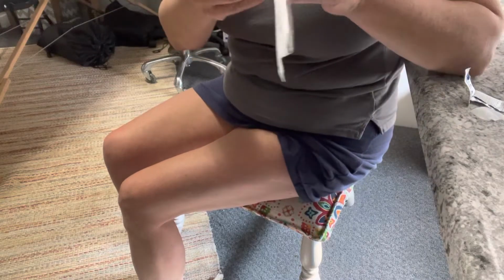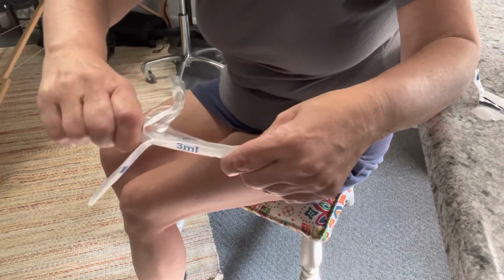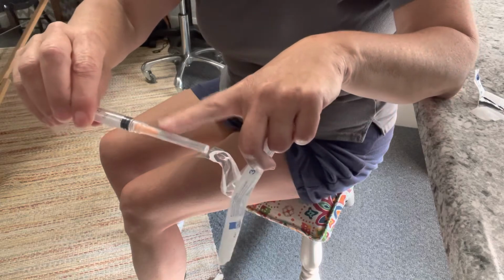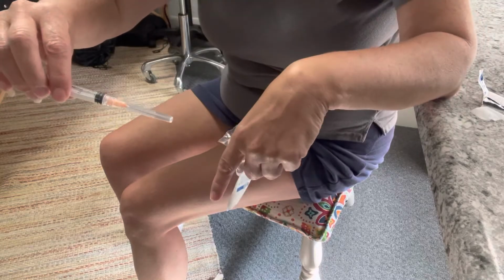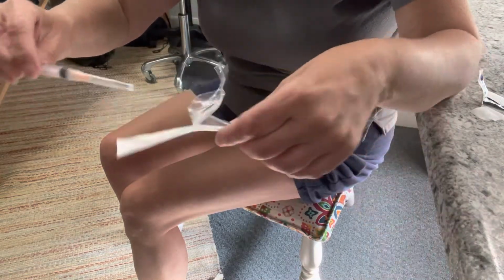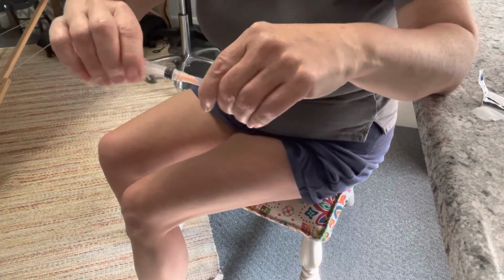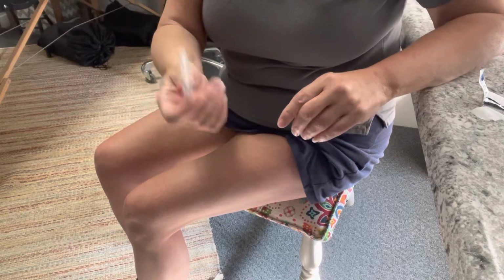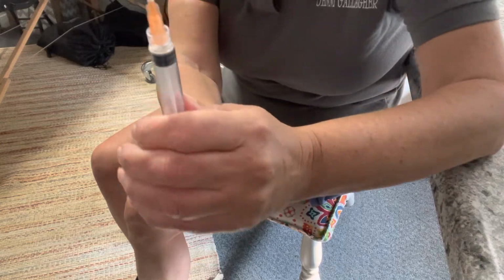I'm going to take my syringe and open it up. Before I pull it out of the package, I want to twist to make sure that the syringe is attached to the needle part. I have opened packages before, and when I pull it out, the needle falls to the floor, like it's not secured. So you want to make sure that is secured before opening. You can do it now as well, but if it's loose and falls off at the beginning, then you have to start all over.